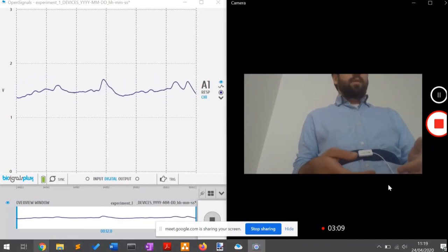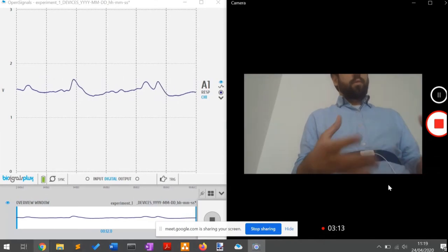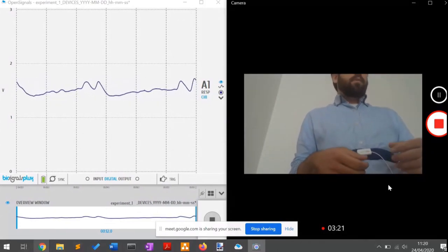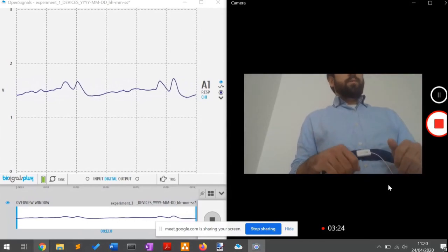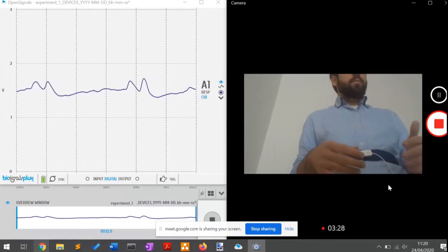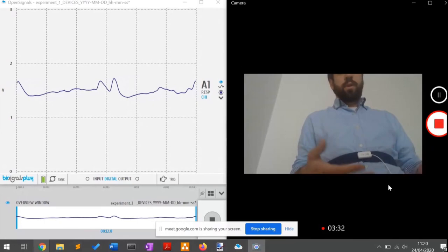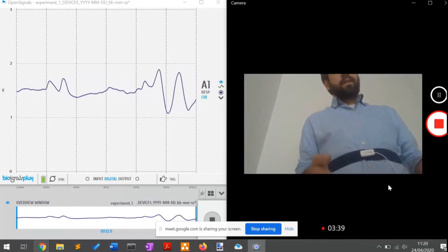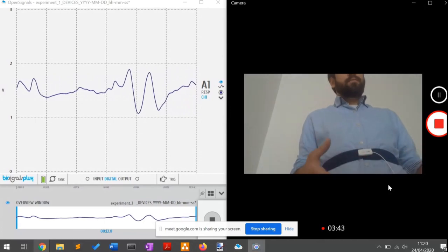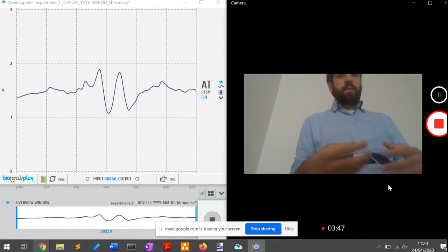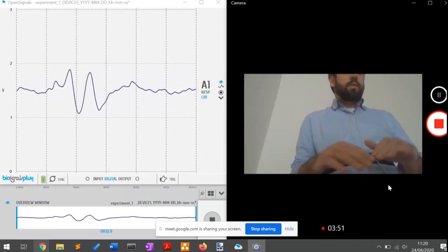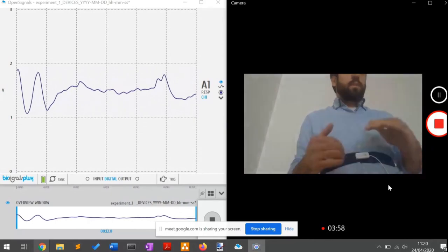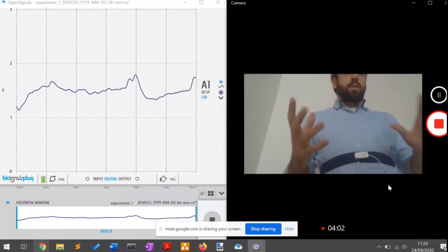This is only important for applications where we have just the respiration — controlled respiration where we induce holding the breath, or we have normal respiration. If you look at the signal now, it flattens, basically because right now I'm talking and I cannot breathe at the same time. While I talk, I'm not actively doing cycling breathing mechanics, so that's why the signal starts flattening. Because talking also involves some body movement, you see some small motion artifacts on the baseline.